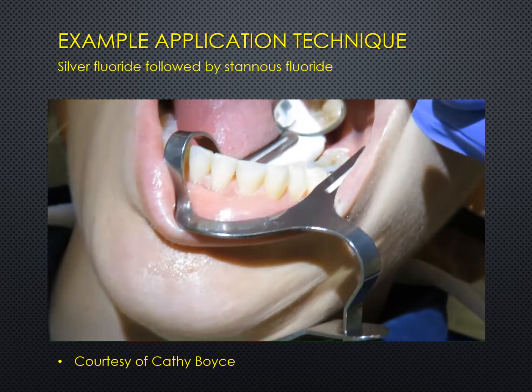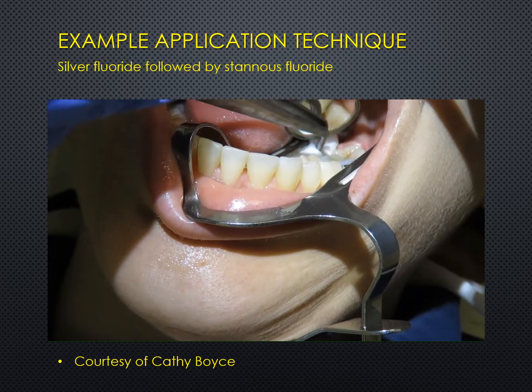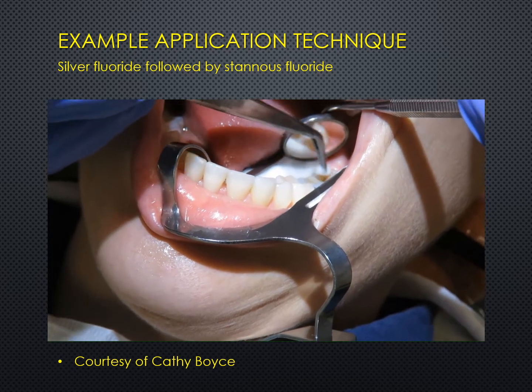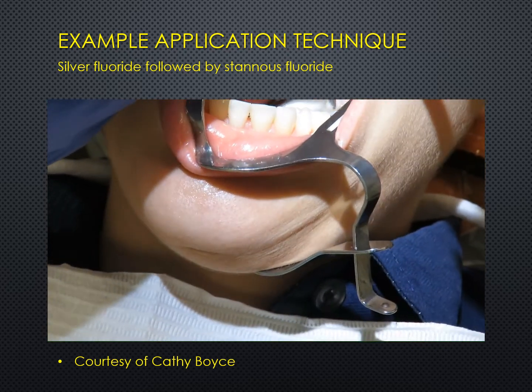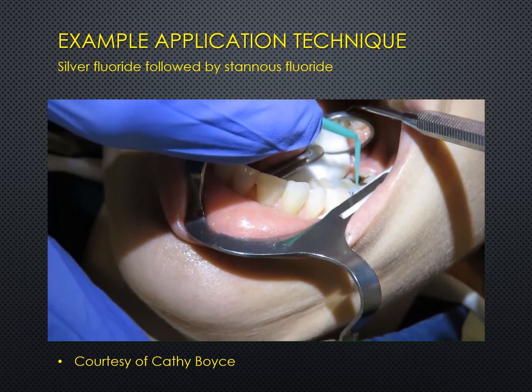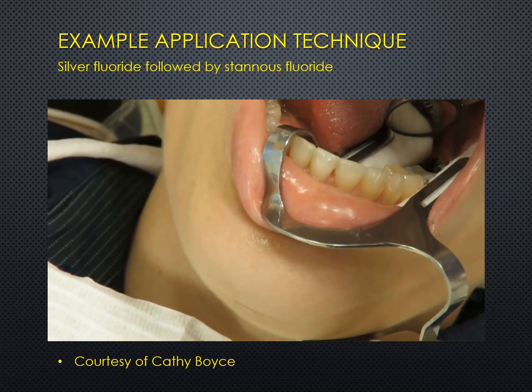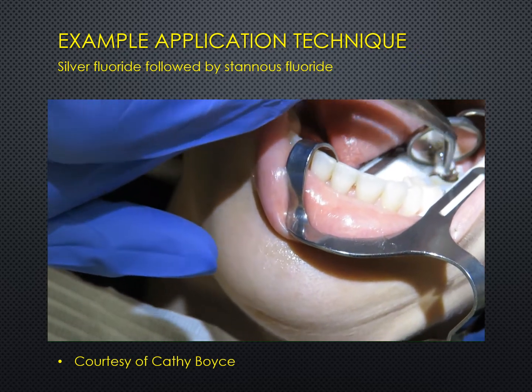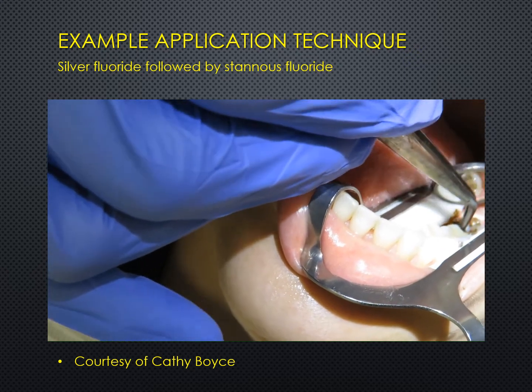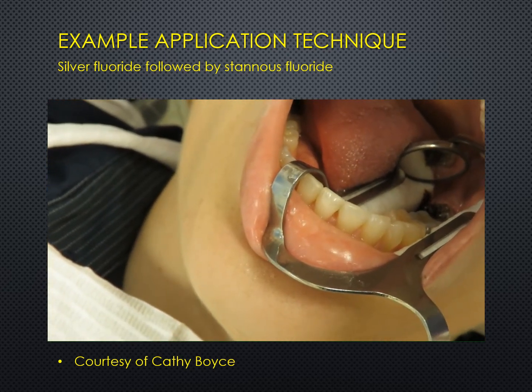We're going to leave that there for three minutes, and once that time is up we'll apply the stannous fluoride. Three minutes is ideal, so we wait. Now I'm mopping up the excess and then applying the stannous fluoride to the tooth. You'll notice that it begins to turn black — that extremely black, messy appearance will not stay like that; it will only be the areas of decay. Remember this tooth had already been treated with silver fluoride before, and we're giving it a top-up to last this patient until the current crisis is over and life can return to normal.